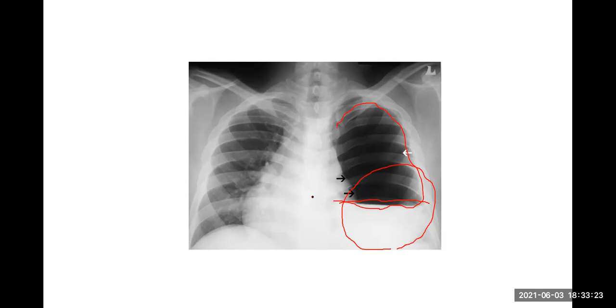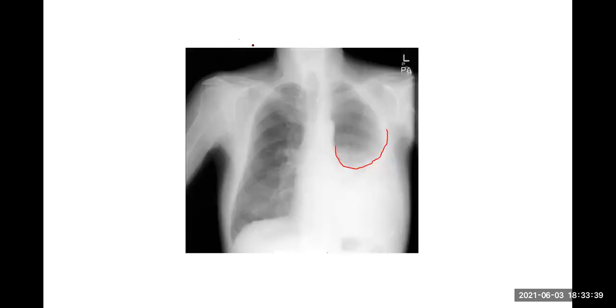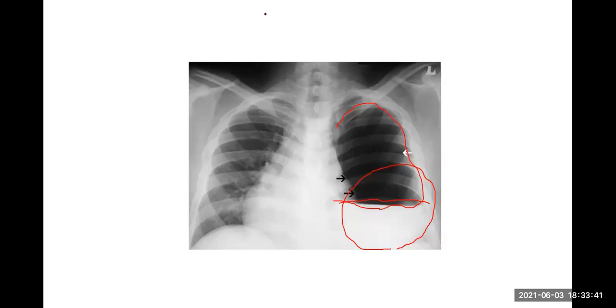Hydro means water. You don't know what it is, what is inside it. In trauma, you commonly see hemopneumothorax, where there is blood in the pleural cavity. So what is happening is there is gas and blood. So the meniscal upper border that you saw in the previous slide is now flattened out. And you can see this air also here, that is gas. There is a pneumo component there.